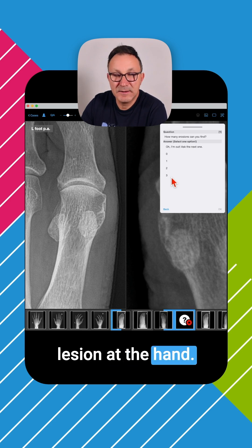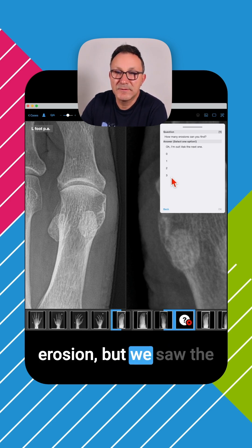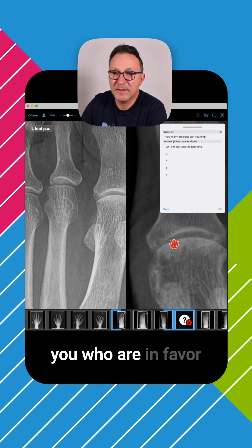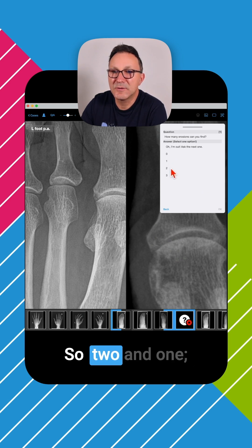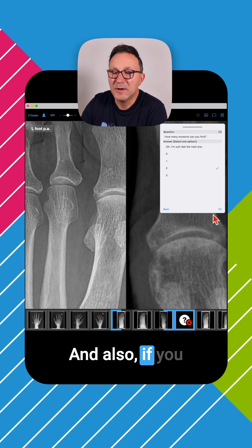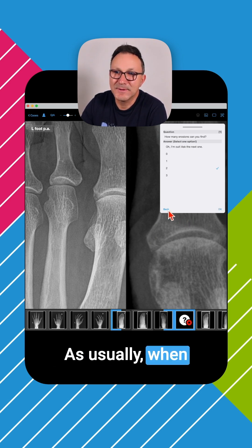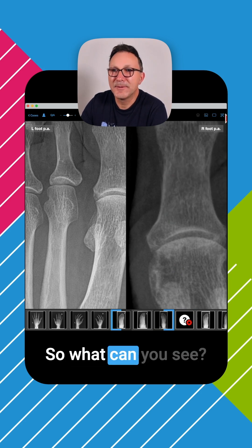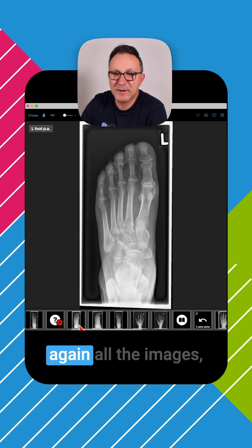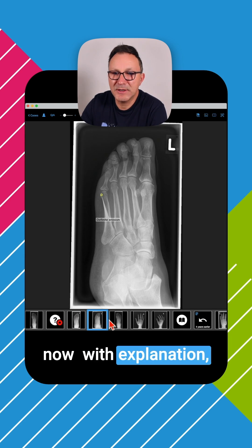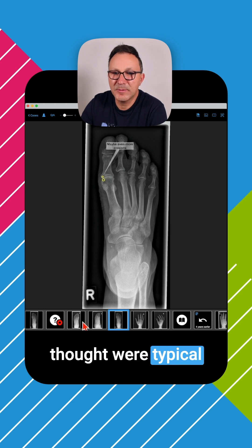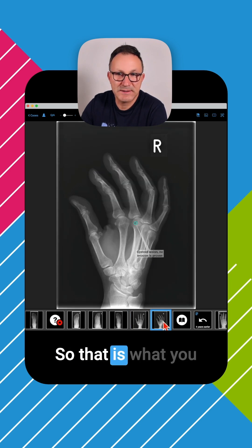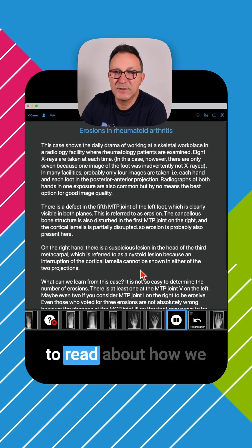We saw the lesion at the hand — I think that was not compatible with an erosion — but we saw the lesion at the fifth toe, which is an erosion. And also for those in favor of an erosion at MTP joint 1, both 2 and 1 are the correct answers. After you answer the question, you see all the images again with explanation, showing which lesions we thought were typical for erosions marked in yellow. We also called the hand finding a cystoid lesion, not an erosion in a proven sense. You also get a learning text to read about how we do the interpretation of these changes.